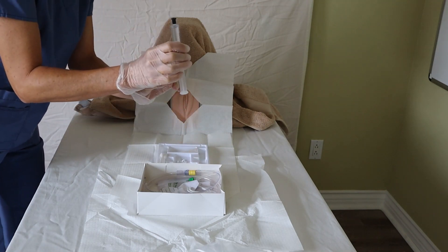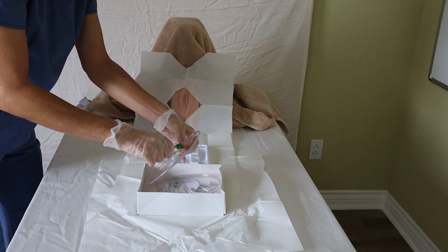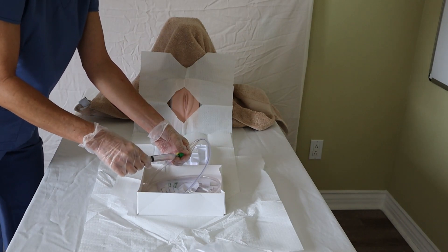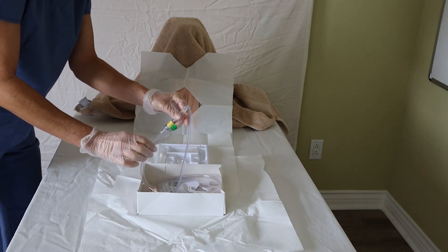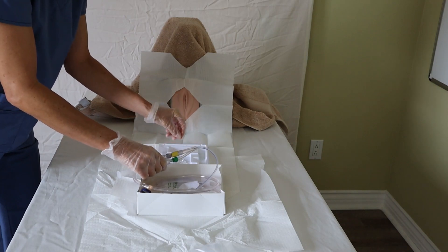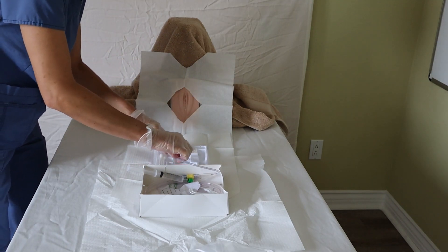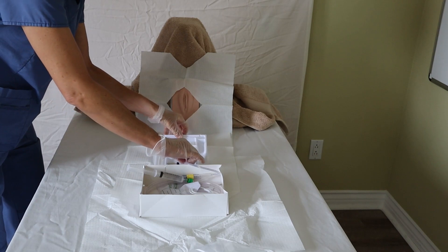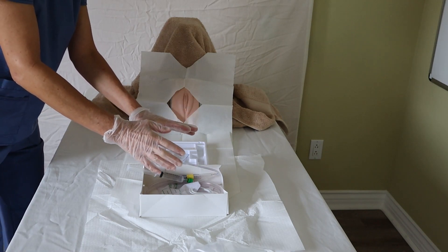I have my prefilled syringe which I will hook up to the balloon inflation port of the catheter. Check the policy where you work because the policy might say to inflate the balloon ahead of time, or some policies now say don't do that. I'm ready with my syringe hooked up to the balloon inflation port. I can unravel the catheter and stick the tip into the lubricant, making sure I lubricate the first inch or so. I have my cleaning swabs, lubricant, and catheter ready to go.